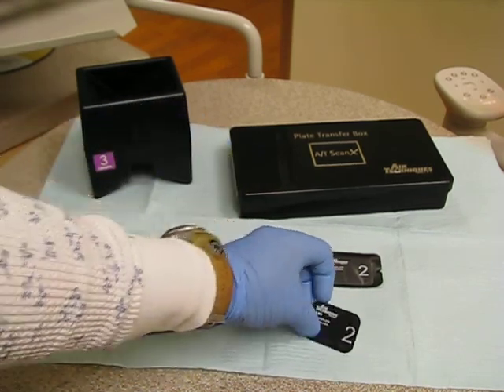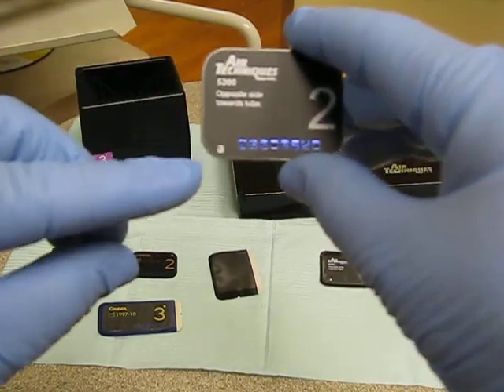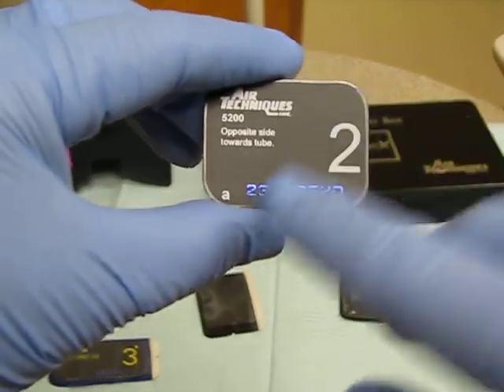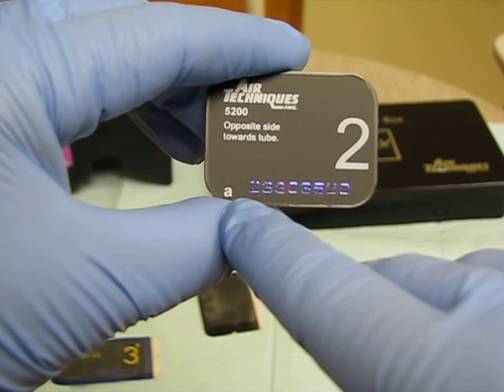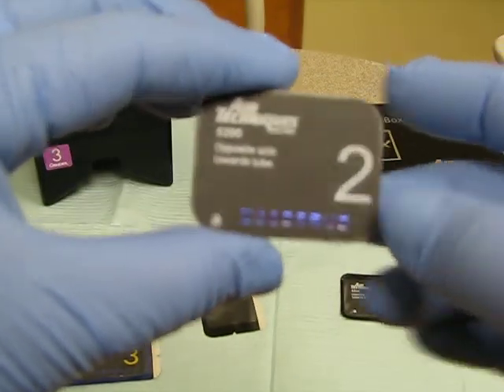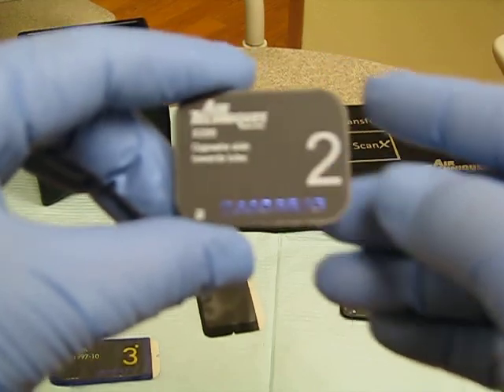Air Techniques is another brand. There again, you see the name, the size, and the serial number. The difference is that on the Air Techniques sensor there's a little 'A' instead of the dot. So Gendex has a gold dot, while Air Techniques has a little 'A' — which of course indicates Air Techniques. There's a little 'A' on the back too, so instead of dot in the slot, if you're using Air Techniques, it will be 'A in the slot.'